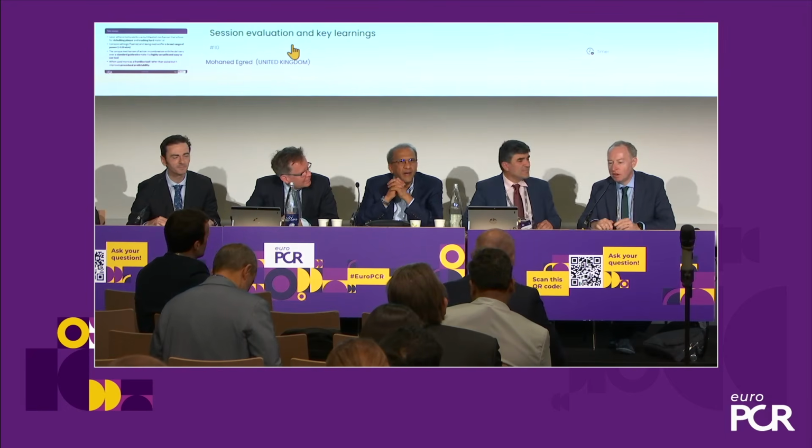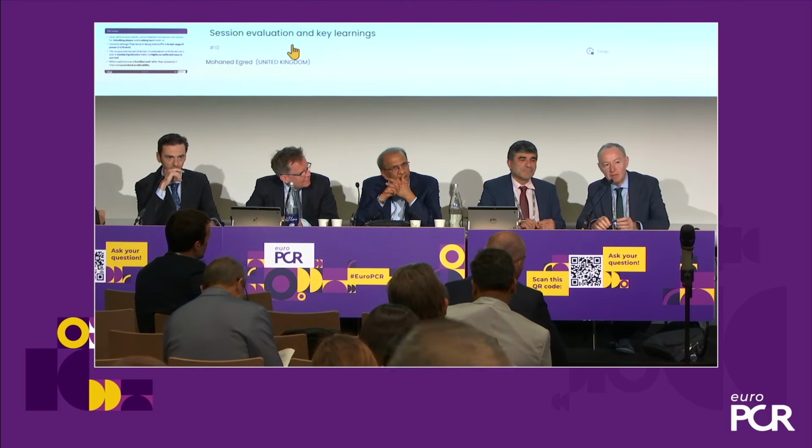There aren't really many contraindications. I think as long as you've got a wire through the lesion fully, as we've discussed, tortuosity can be an issue if it's really extreme, or really heavy calcification, it may not be the very best device, but there's no major contraindications. Just a quick comment about the CTO.